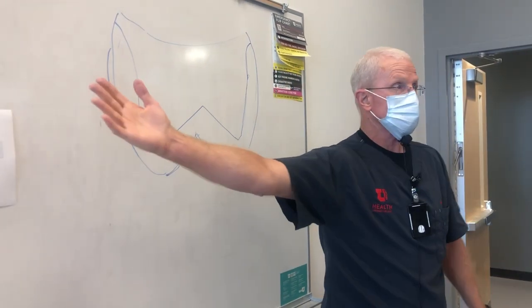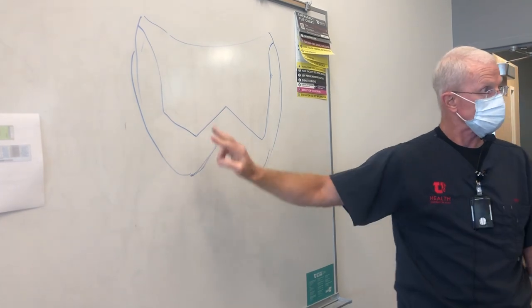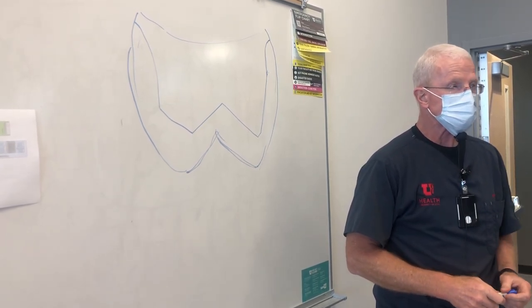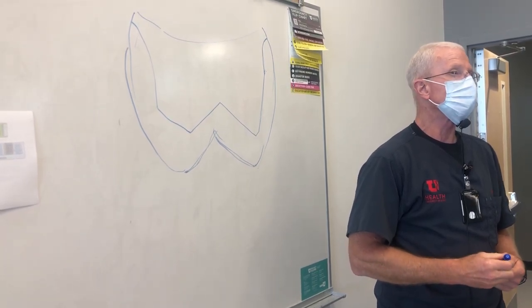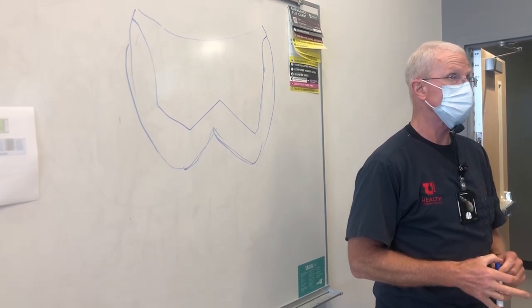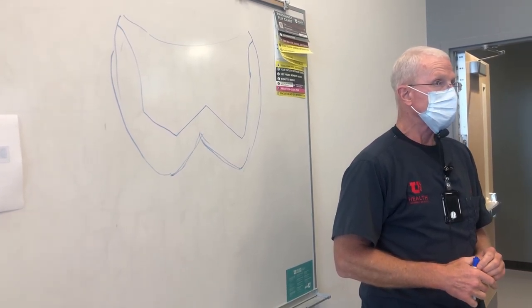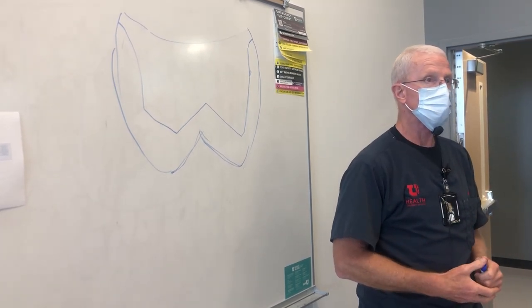You simply make a cross-section through that, and then you can go in with a perio probe and see that you've reduced the proper amount all the way around the tooth. We don't teach you that method, not because it isn't a good method, but it's not real practical. You're not going to be doing that with every crown preparation that you do. You're just going to go in and prepare the tooth based upon this image you've built into your mind of what the ideal preparation looks like.